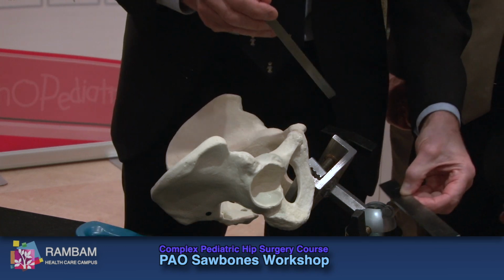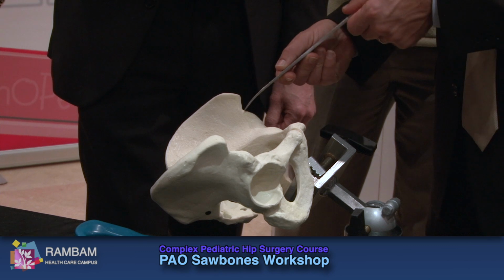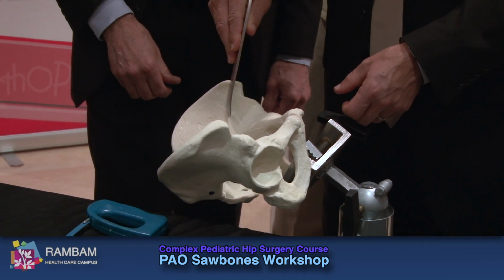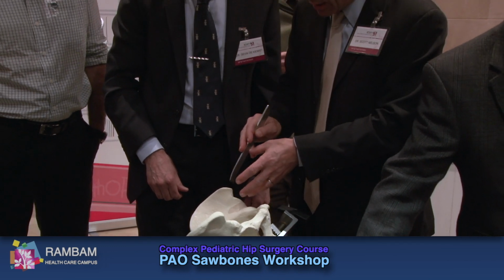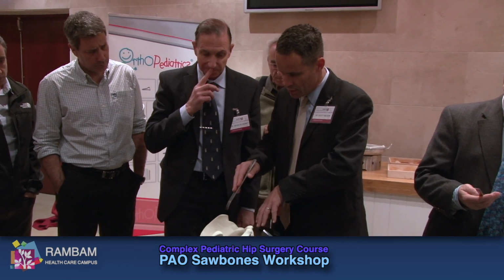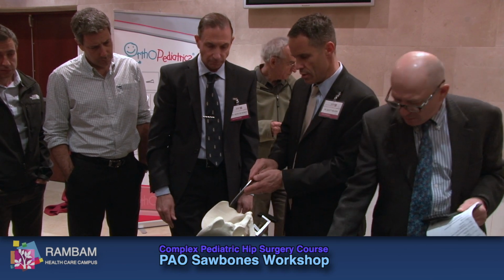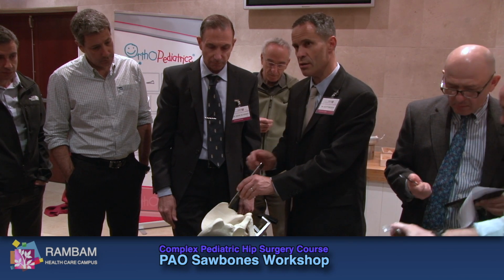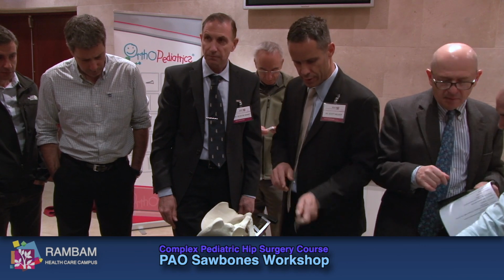Okay. And then one other, I don't know what your comment is on this, but when you're cutting this one straight down here, it's easy maybe to be like this a little bit, but you really need to be a little bit rotated this way, because when that adducts, you want those surfaces to slide on each other. If it's cut this way, when it adducts, it's going to pull apart. So having it slanted with this lateral edge a little inferior to the other edge is important. It's basically perpendicular to the slope.